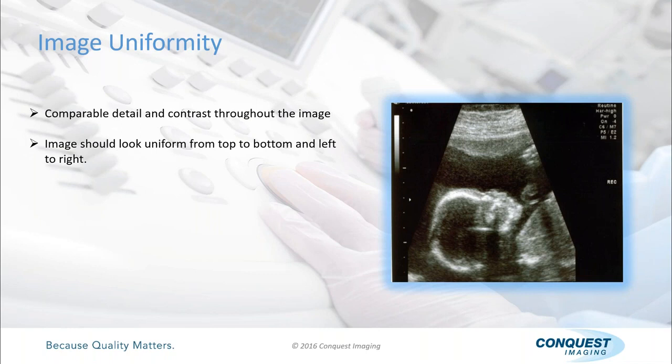If it was originating from the top, absolutely. Then you could say we probably have weak crystals or dead crystals, right? It's been dropped, or in all likelihood, the cable's been run over. Something happened. But in reality here, what we have is a baby's hand and another hand. So it's going through a lot of bone, and it gives up acoustic energy. What you get underneath that is a shadow. The same thing is going to happen on your Phantom when you're imaging from the top going down. This is going to take up a lot of the acoustic energy. It's very dense like bone, so you'll get a shadow underneath of it.